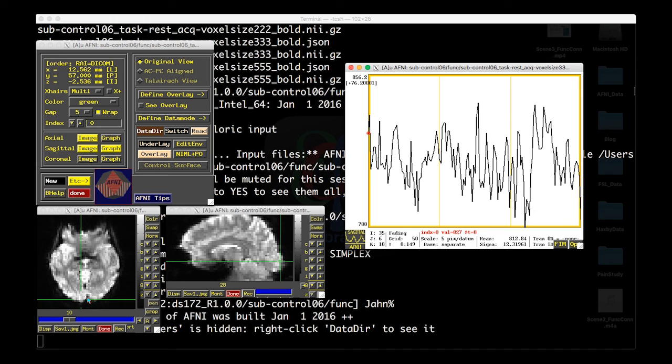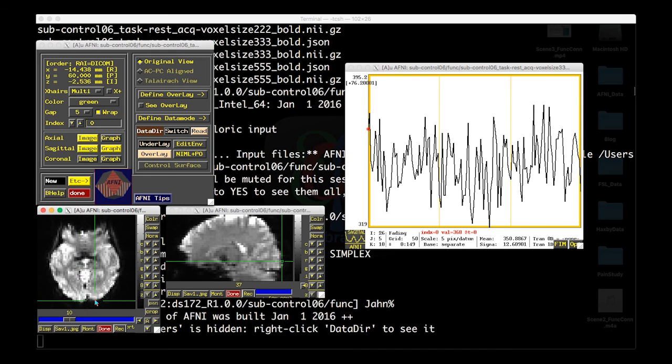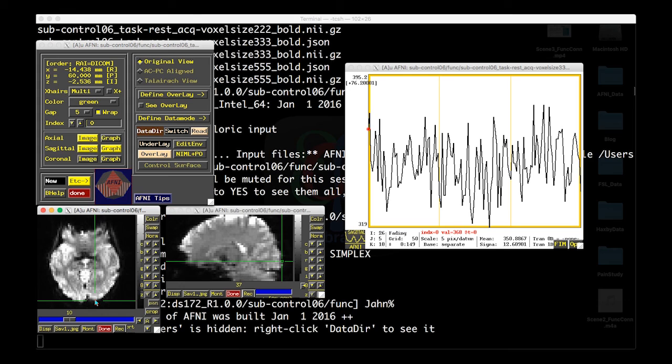Now, the visual cortices, the left and the right, are pretty reliably correlated under resting state conditions. It's a very reliable resting state network. So if I click on a voxel over here on the left, and I click on a voxel over here on the right, it's hard to tell right now without doing the formal comparison, but I'm assuming that these two voxels would be relatively well correlated. When one goes up, the other one goes up, and when one goes down, the other one goes down, in general.